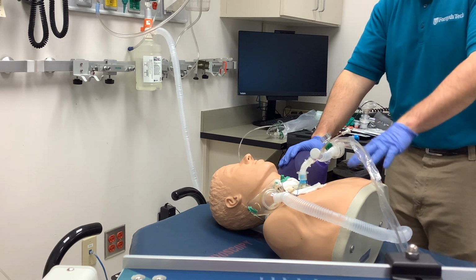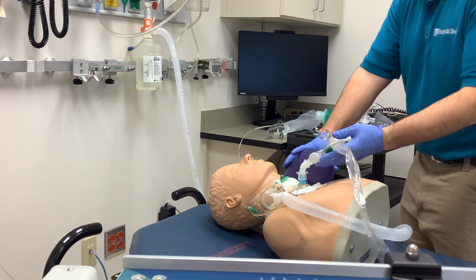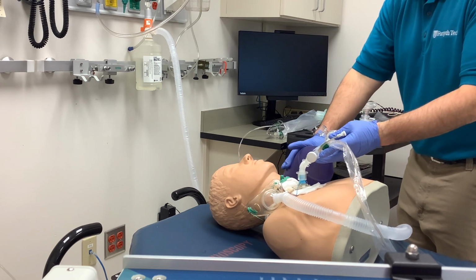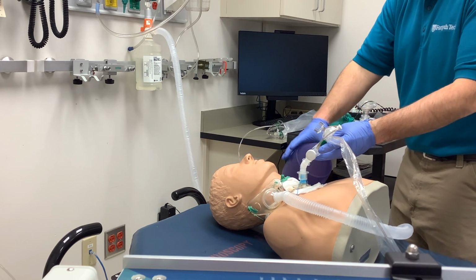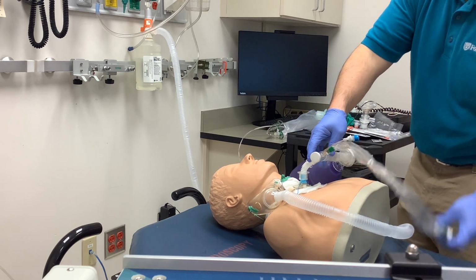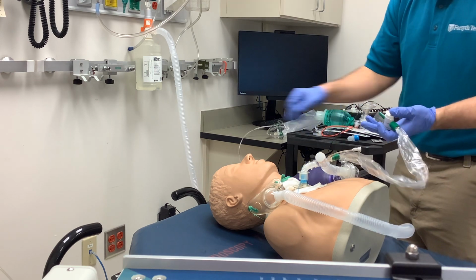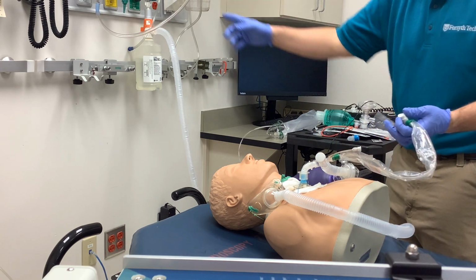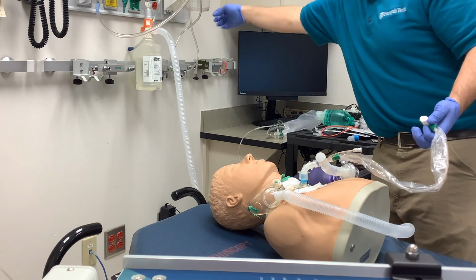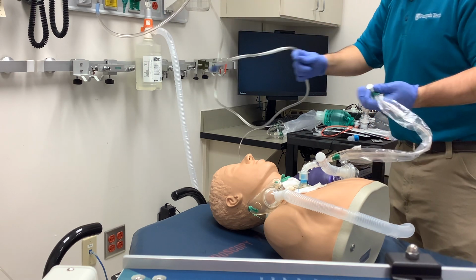And because this mannequin doesn't have a set of test lungs in it, I can't actually deliver a breath, but you can breathe 100% for your patient. And then after you've hyperoxygenated with a few breaths, or for 30 seconds to a minute, you can now take and suction your patient, attach your vacuum tube in here from up here. I'll go ahead and take the time to do that so I'm not halfway doing anything for you.